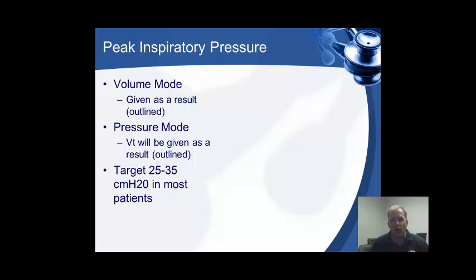We're probably going to use volume mode most of the time, but you should understand what the difference is between volume mode and pressure mode.